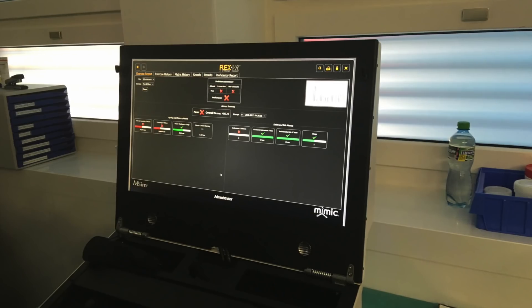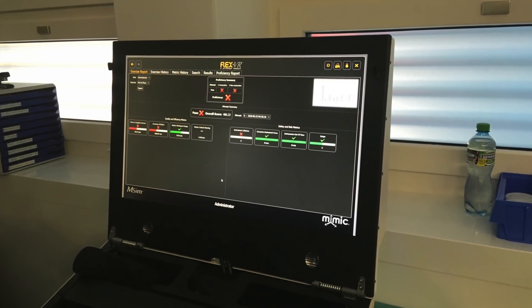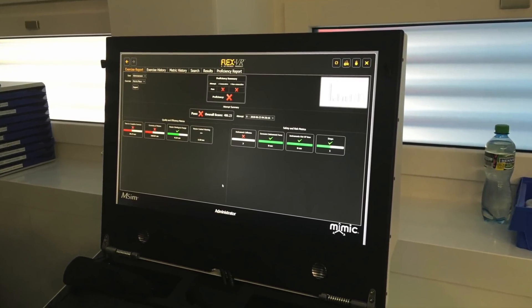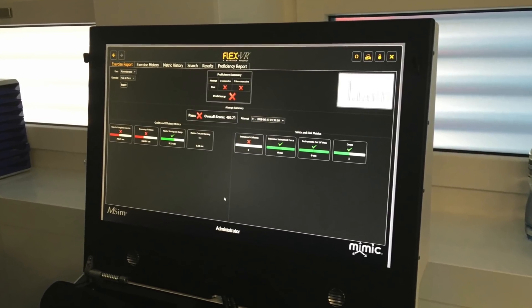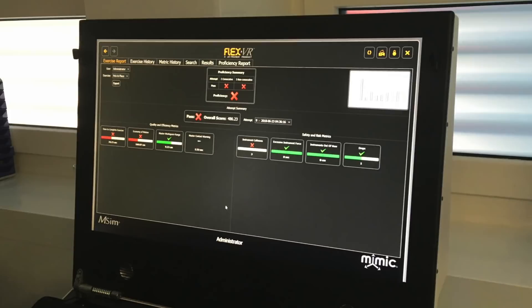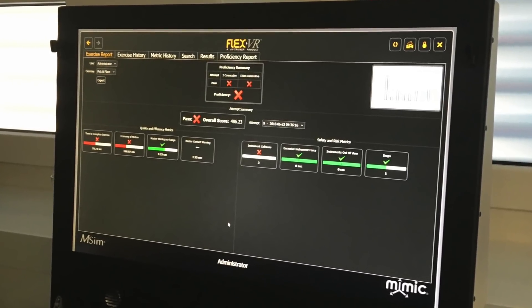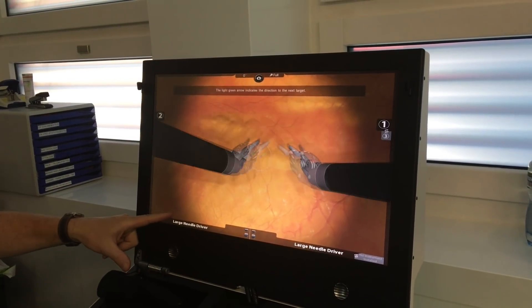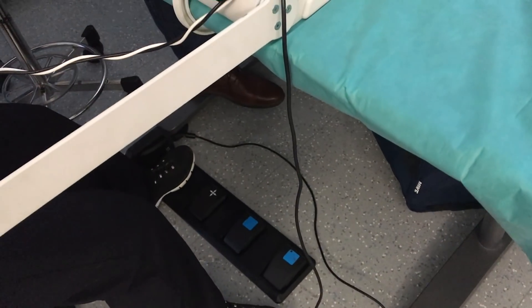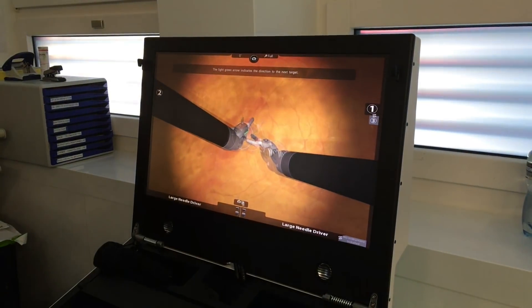One thing the original system does not have is analysis of the exercises — for example, how many moves you did or how many instrument contacts you made. There are many different exercises from basic moves up to complicated surgery, all in 3D. The foot pedals are there too, with a slightly simpler layout, but everything is in its place.